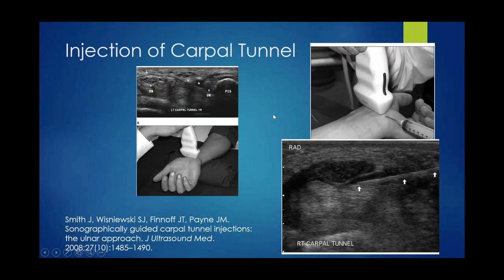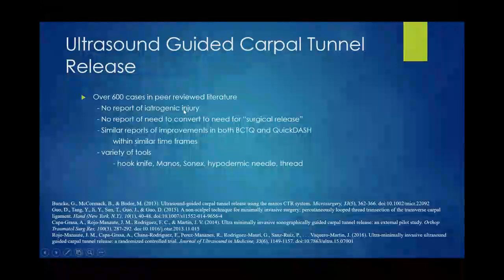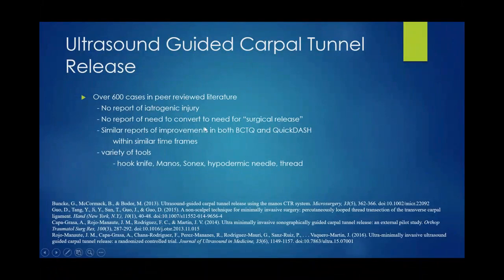Again, as technology advances and operators become more skilled, we're verging on doing surgical procedures with ultrasound guidance. There have been over 600 peer-reviewed cases in the literature with no report of injuries, no need to convert to a surgical release, with similar outcomes as would be reported with open and endoscopic release. The procedure has been performed with a variety of tools, either hook knives borrowed from surgery or devices created specifically for the procedure.